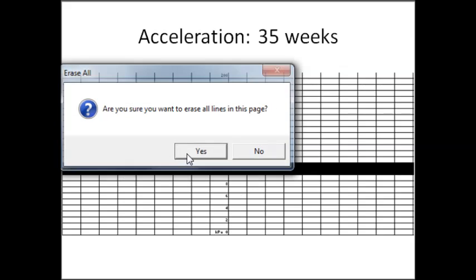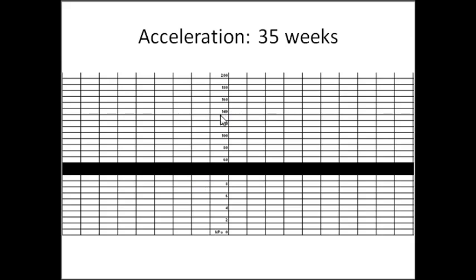Let me draw in an acceleration here. I kind of free-handed it otherwise, but we're gonna say our baseline is 140 right there. So we've got our baseline, and then there's 1. Here's 2. Okay, so what did I just draw? This one right here, you can tell that our baseline is 140, and it went up to about 155. So going up one line is 10, and a half is 5. So it went up about 15 beats per minute.